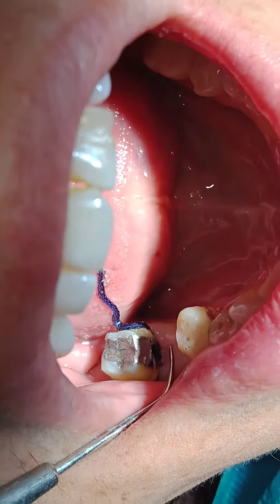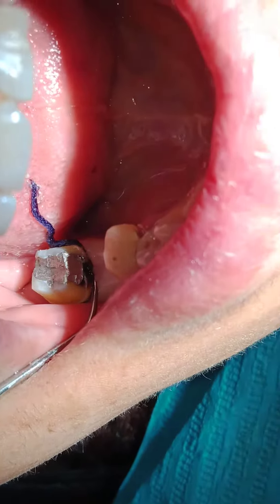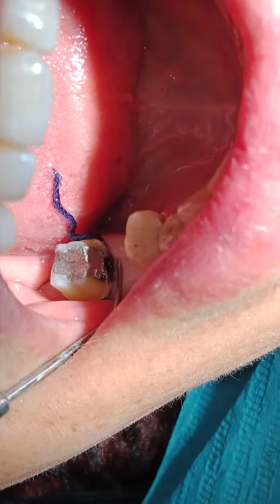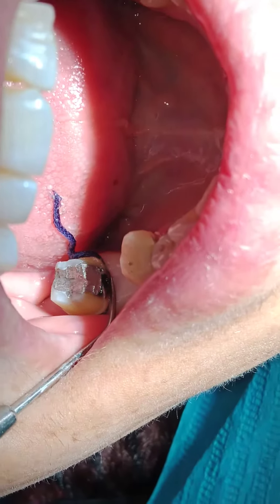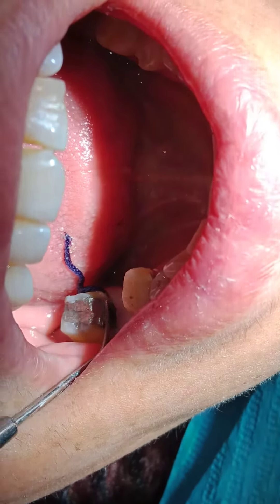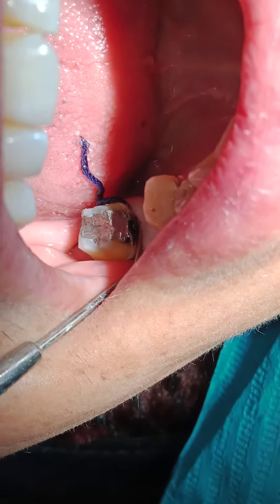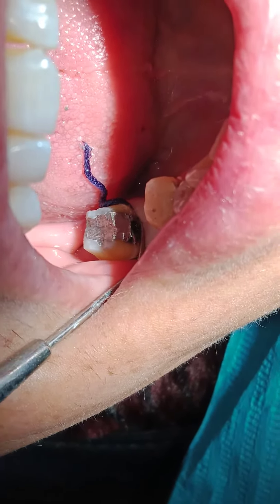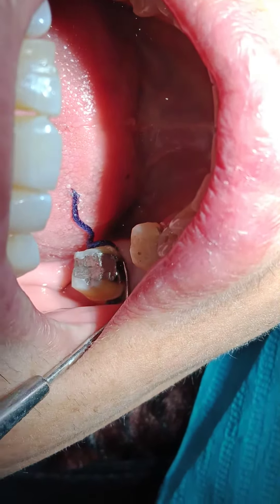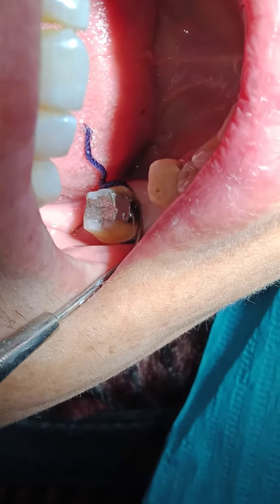The idea here is that this tooth — the area of the gingiva — is not clear, so I need to clarify the area. When I put a retraction cord without any hemostat, the gingiva is not bleeding and nothing is a problem. The dry retraction cord, once you place it, drives the gingiva more apically. So you see now better where the margin of the amalgam is and where the secondary caries margin is. The first function of this retraction cord is going deeper to expose and drag the gingiva more apically.